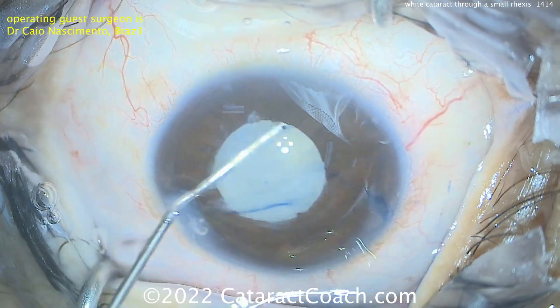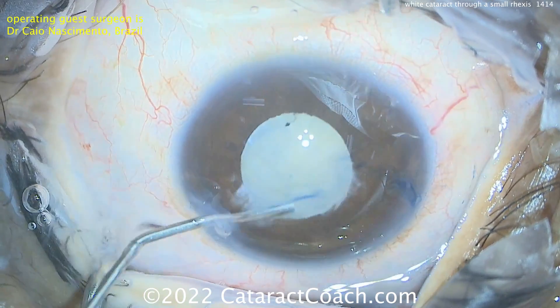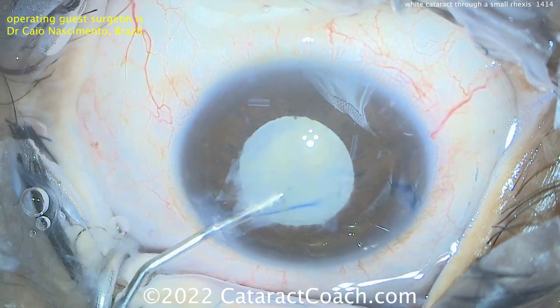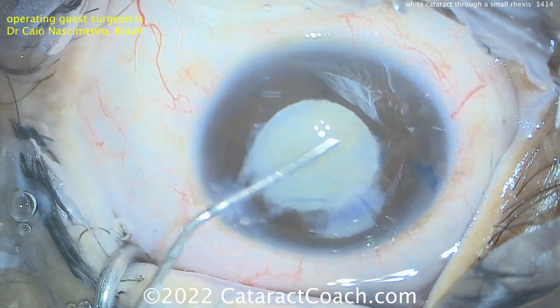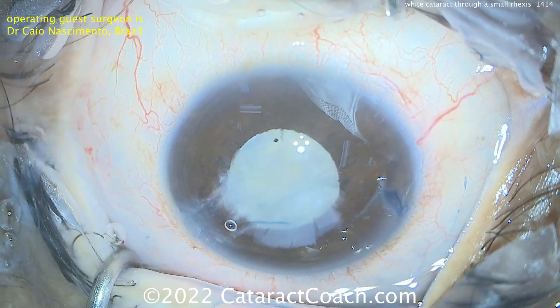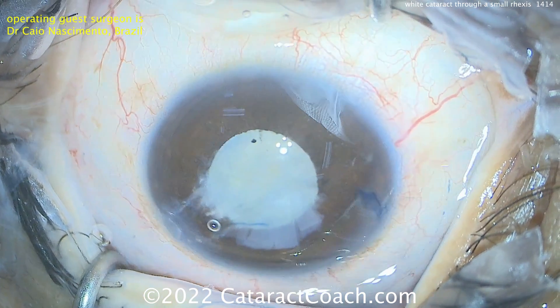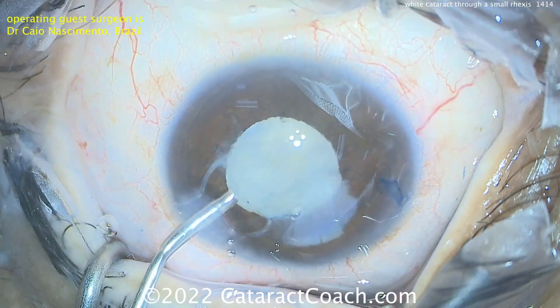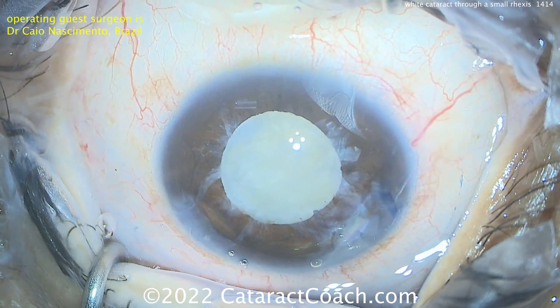And now a little more viscoelastic going inside the eye, trying to bring that nucleus up. You can see the main position here is for the left hand, so it looks like it's a left-handed surgeon — or at least holding the phaco probe in that left hand. A lot of time spent really freeing up that nucleus. That's going to facilitate things and make nucleus removal a whole lot easier. And here's a little more viscoelastic. I think we're ready for that phaco probe.